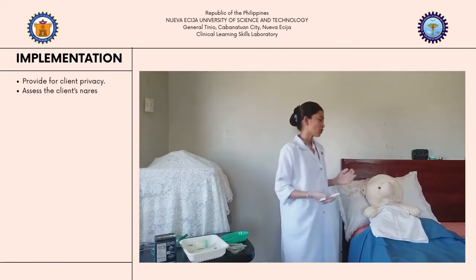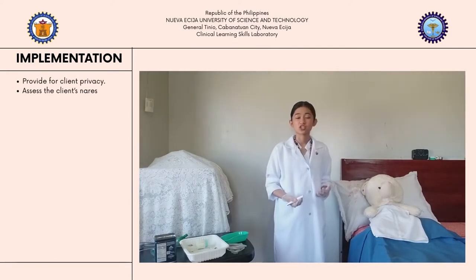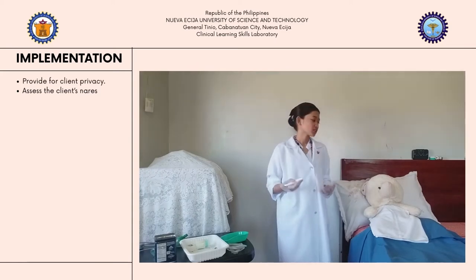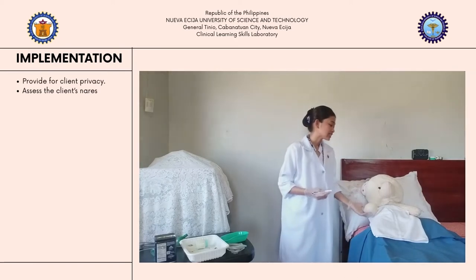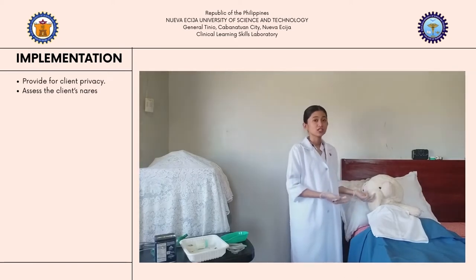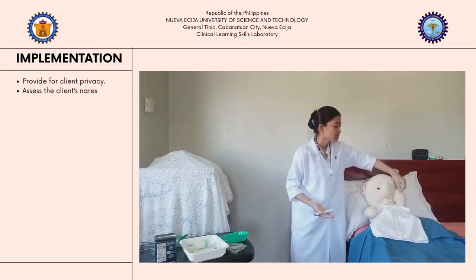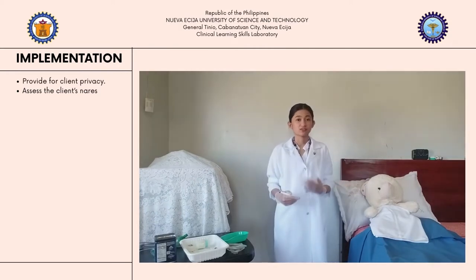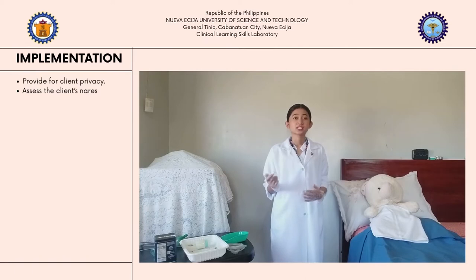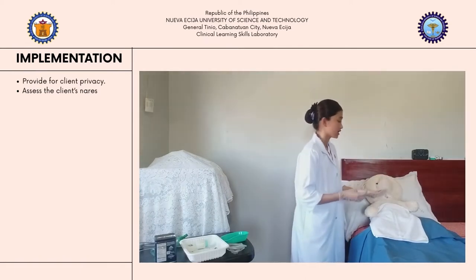Then, examine also the anatomy or the structure of the nose for any obstructions or blockage, such as a deviated septum, for us to avoid those areas and prevent injury. And lastly, we can also ask the client to occlude one nostril and breathe through the other, and do this to the other nostril as well. This way, we can determine which nares has the greater airflow, and that nares is where we will insert the tube. Now, I will assess the nares.